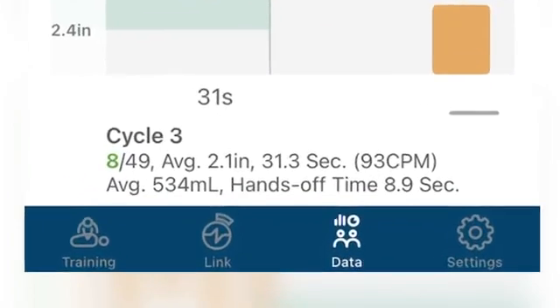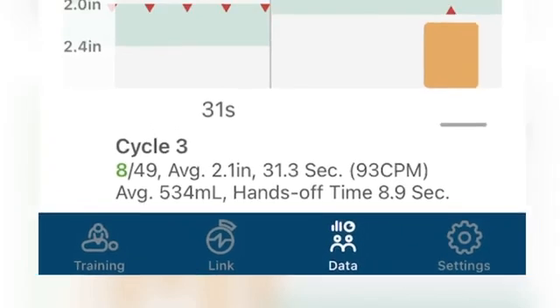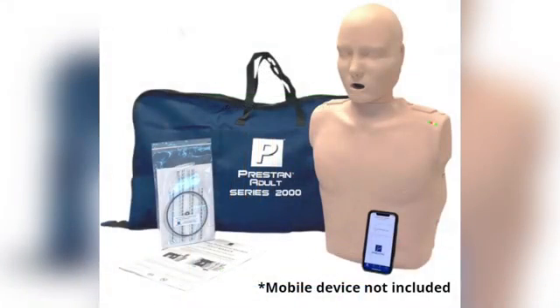This data includes current cycle number, ratio of good compressions over total compressions in the cycle, duration of the cycle, average rate of compressions, average volume of ventilations, and the hands-off time of the cycle. For more information on the Prestan Professional Adult Series 2000 Mannequin, please reference the instruction sheet, troubleshooting guide, and frequently asked questions available on the Prestan website at PrestanProducts.com.